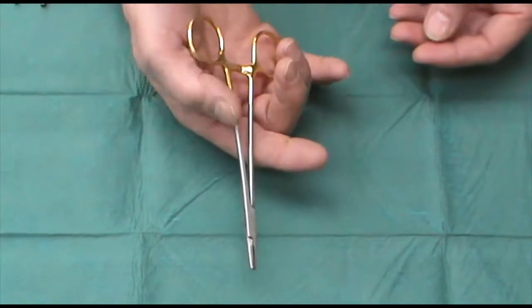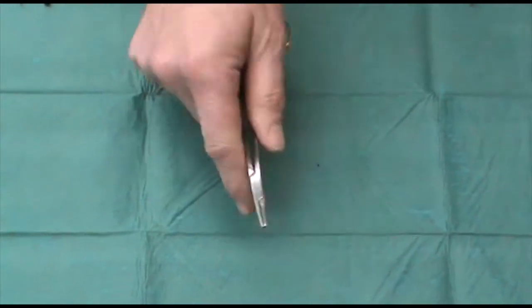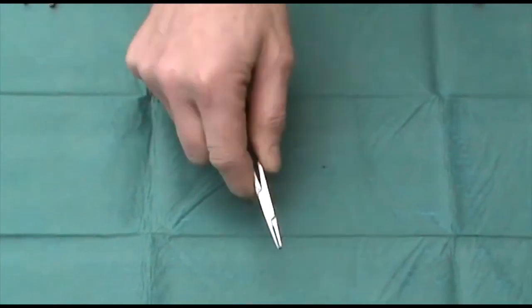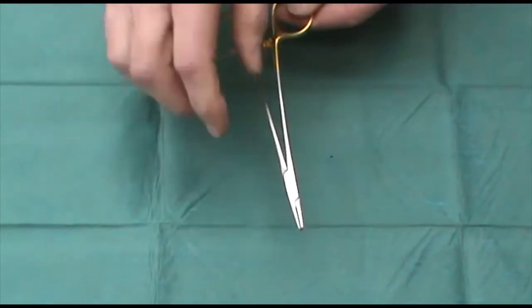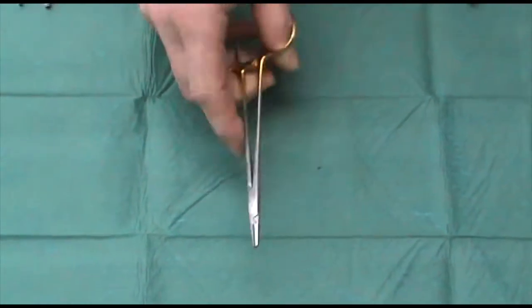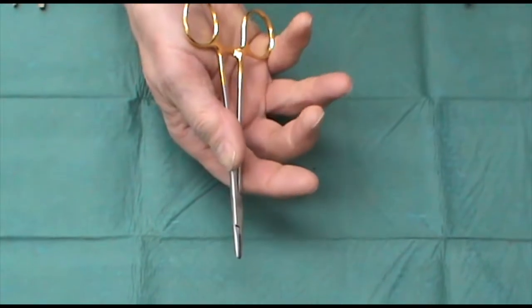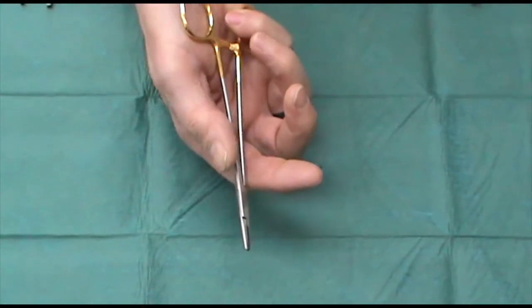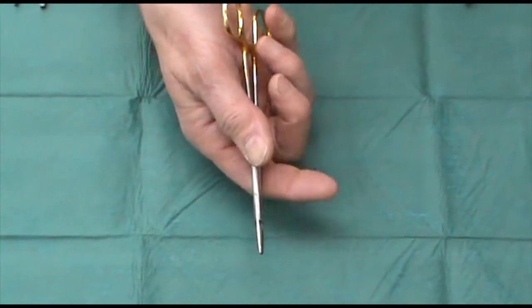They're of the right length so that you can hold and release in this so-called hand or plastic surgery grip, which I find a better way of controlling it than holding it in a more traditional way. They have a very delicate ratchet, and often just a single click is all that you require for holding on to a needle.